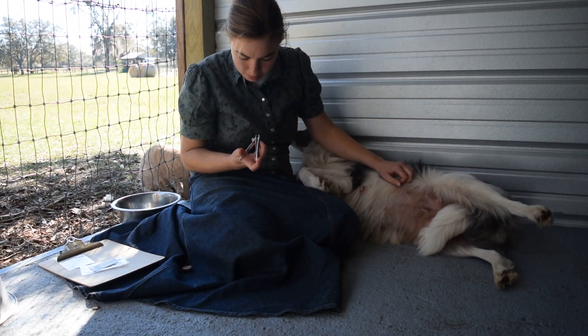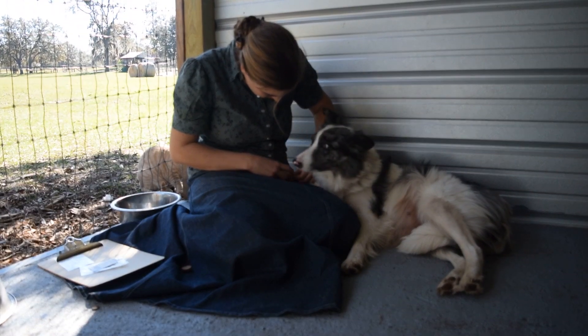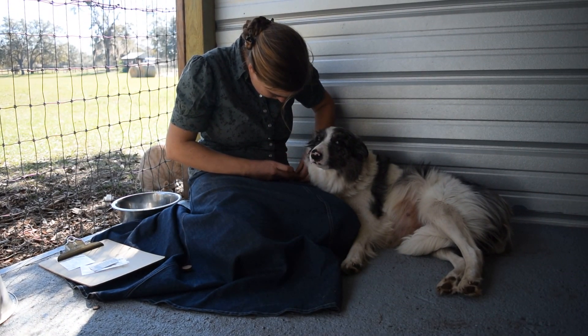I'm running into a bit of a problem in that my clippers are too small to fit all the way over her nails. I'm just going to have to do the best I can.